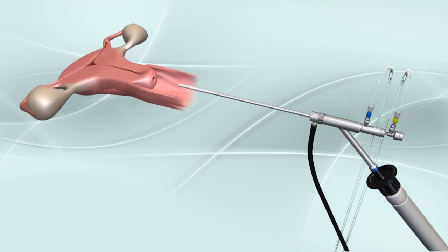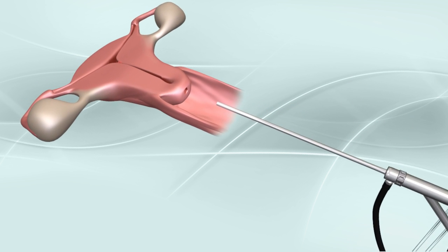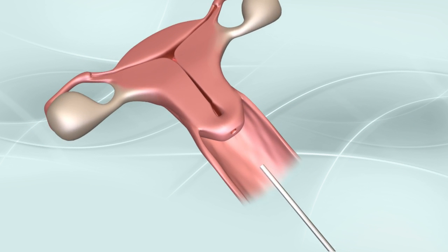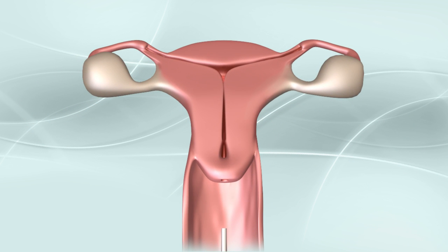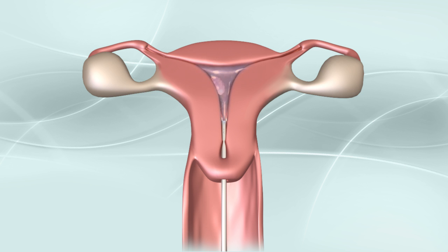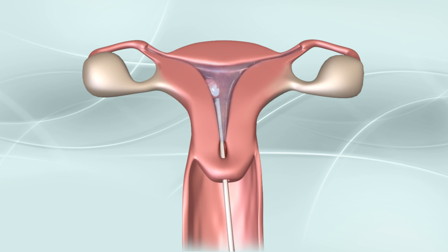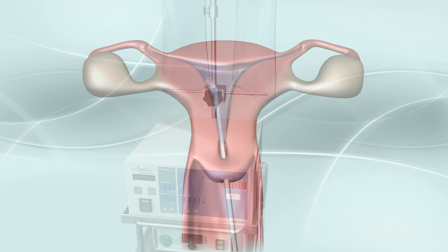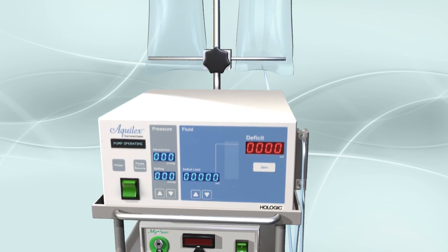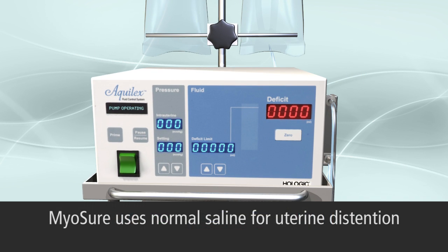The Myosure system enables simple and efficient hysteroscopic removal of tissue. To achieve and maintain uterine distention and optimal visualization while rapidly cutting and removing tissue, it is important to understand the unique fluid characteristics of the Myosure procedure.